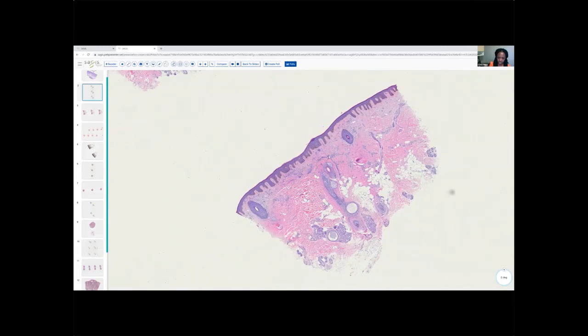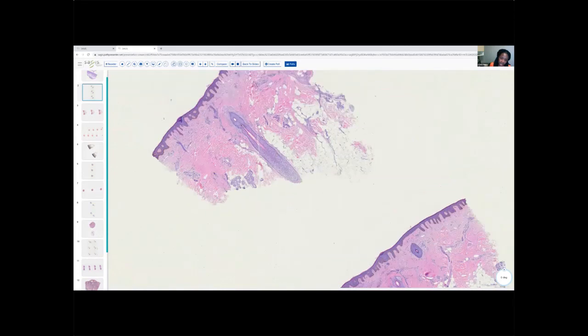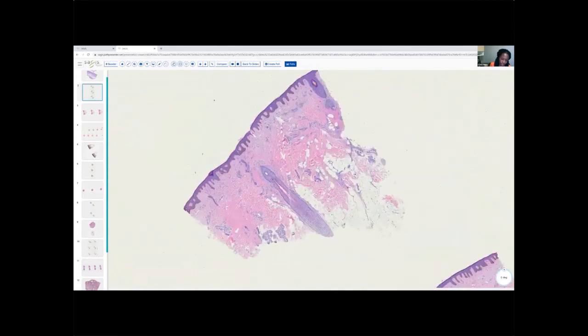So traction alopecia, we have hair loss, we have some of those pigment casts. Because the hair has been traumatized, it's kind of been shocked by this traumatic process. There's a change or an alteration in the follicle. Okay, so that's going to be that shift from those nice open anagen follicles to the catagen telogen.